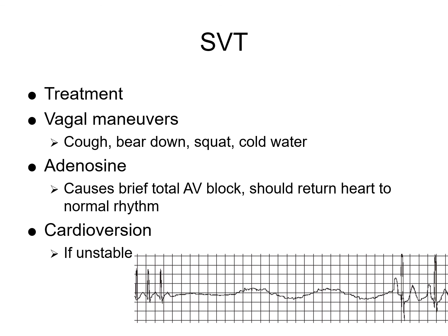It causes basically a total AV block, and then the heart should hopefully return to a normal rhythm, keeping your fingers crossed. I've seen that done before at Lutheran several years ago, where the lady went flat line across a whole length of the screen. We were all holding our breath, and then she came back to normal sinus rhythm. If they're unstable, so if they're deteriorating, with no blood pressure, altered mental status, whatever, consider cardioversion.